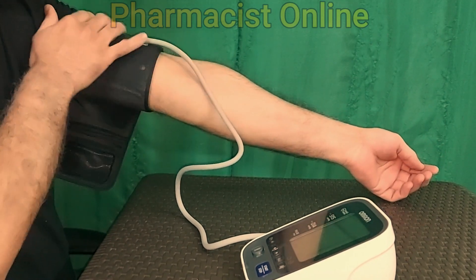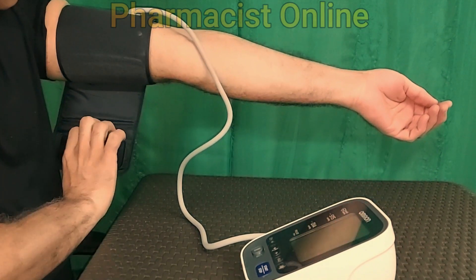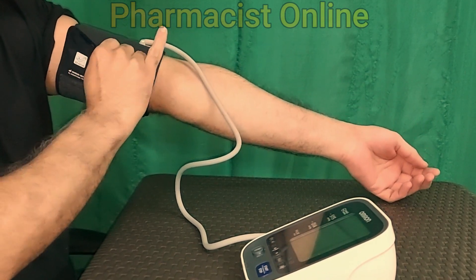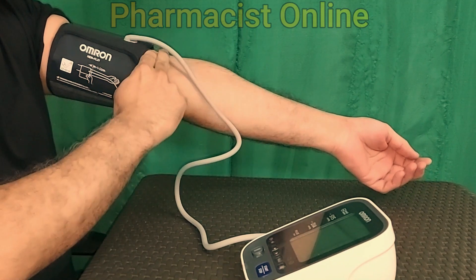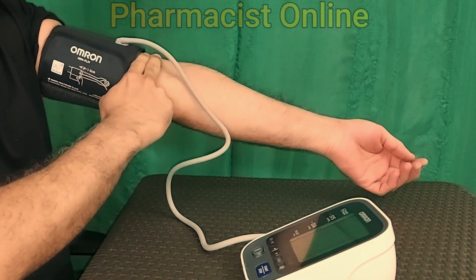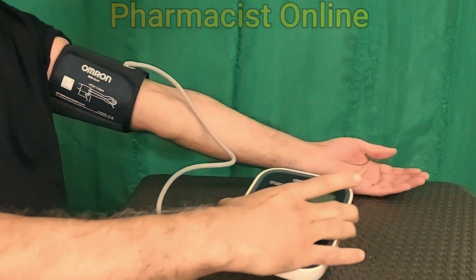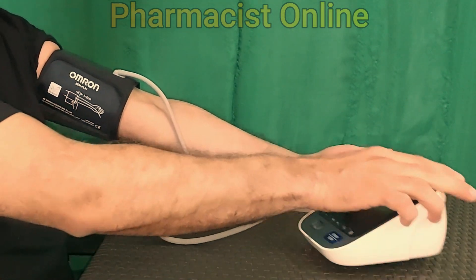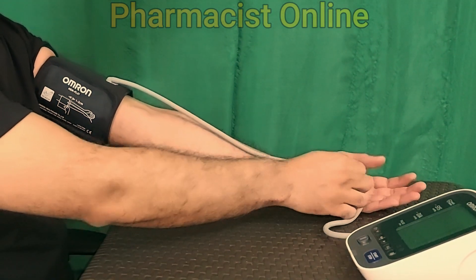Wrap the arm cuff around the arm properly as shown in this video. Keep the cuff above the elbow at least 2 to 3 cm, and also keep the tube in the middle of your hand running down to the palm or middle finger.